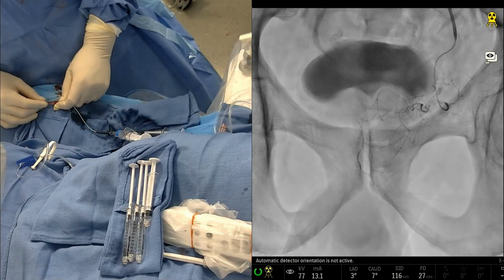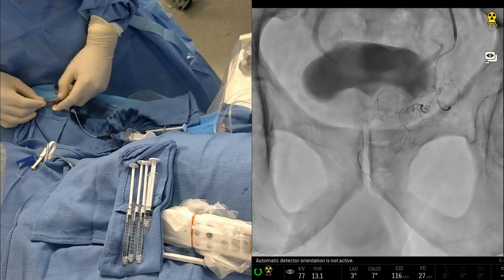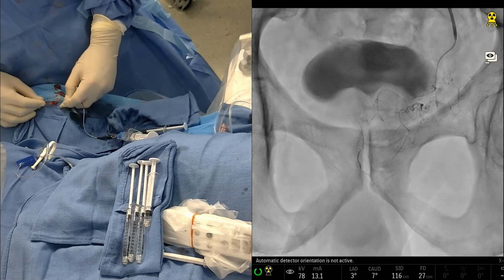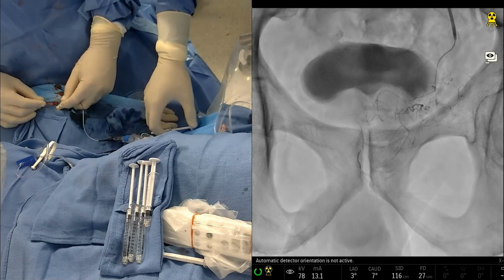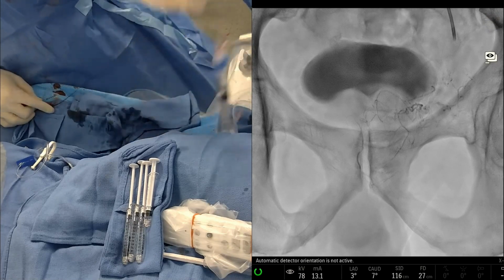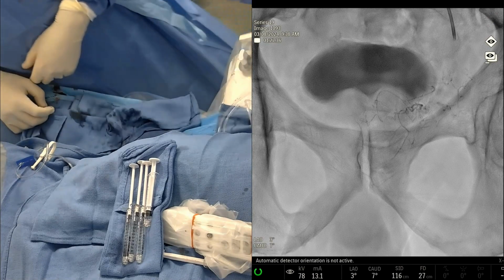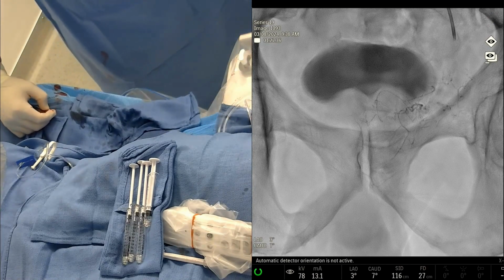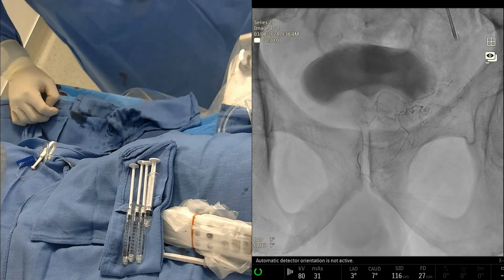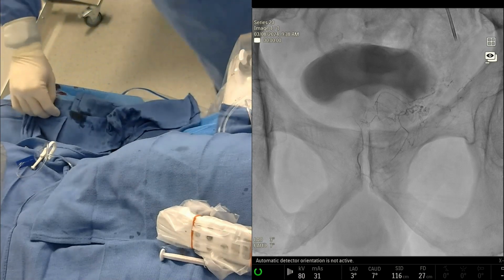So I just took the balloon down, so now we have forward flow, but the vessel's probably occluded at this point. And that's it. The other thing we could do is drop a little bit of glue here just to form a little proximal plug, just a tiny bit, very slow. That's it. And then the other thing that we're seeing here is the amount of time that you have. A lot of people inject the glue and just rip the catheter out. It really shows that with this mix, you have time to be patient and be thoughtful about how you're doing the embolization.